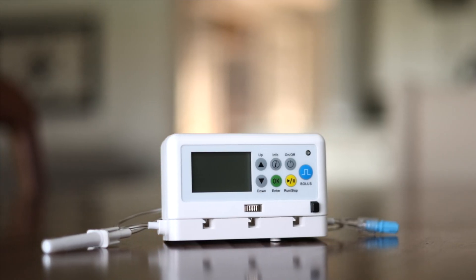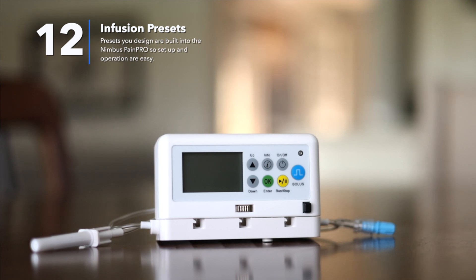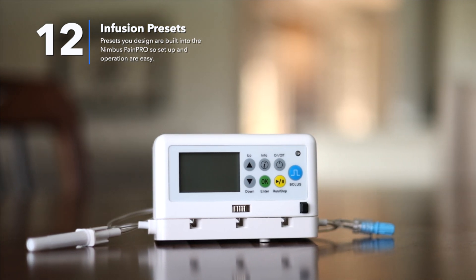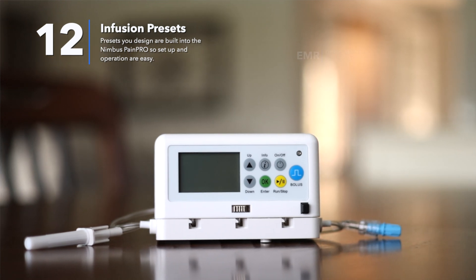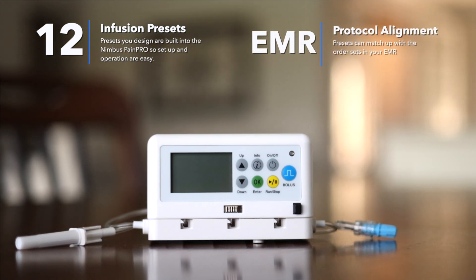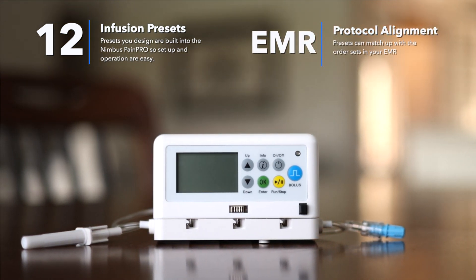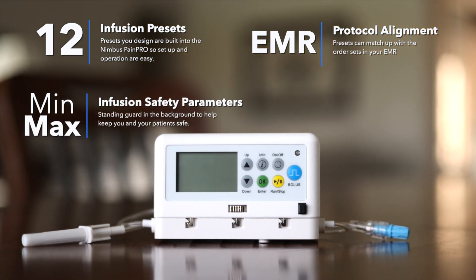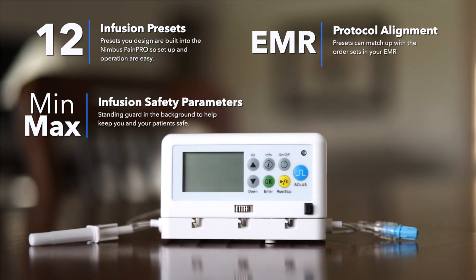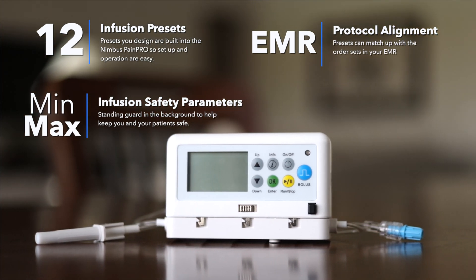The PainPro is programmable with up to 12 infusion protocol presets that you design built-in, so setup and operation by you and nursing is easy. The protocols you build into the pump can match up with the order sets in your EMR, and each protocol can have pharmacy's minimum and maximum infusion safety parameters standing guard in the background to keep you and your patient safe.